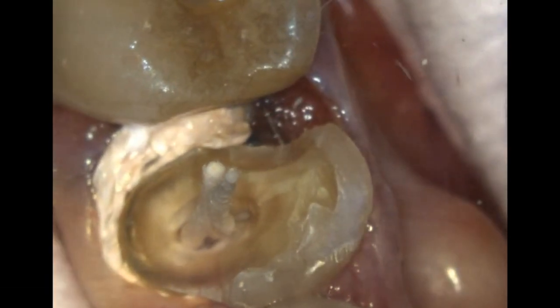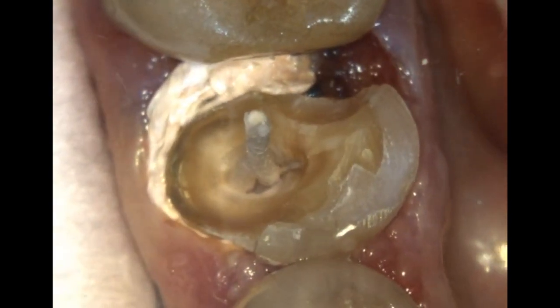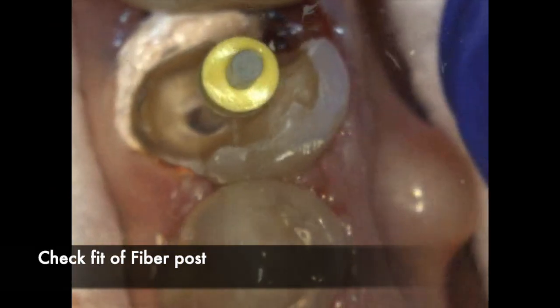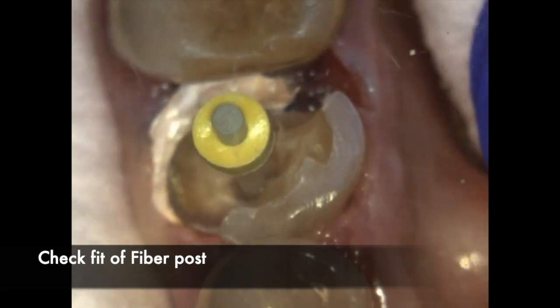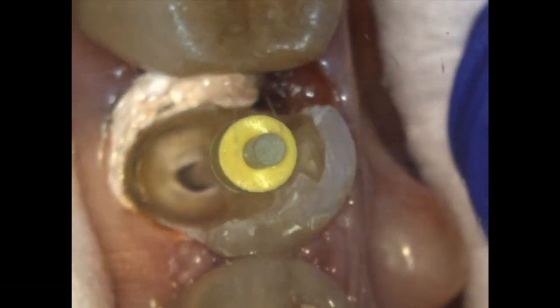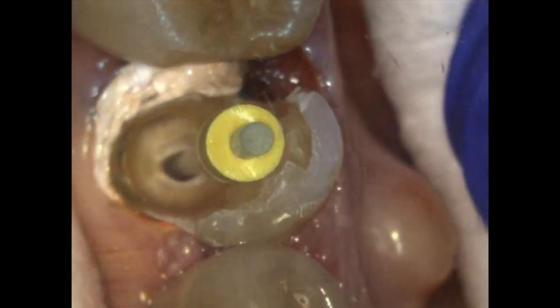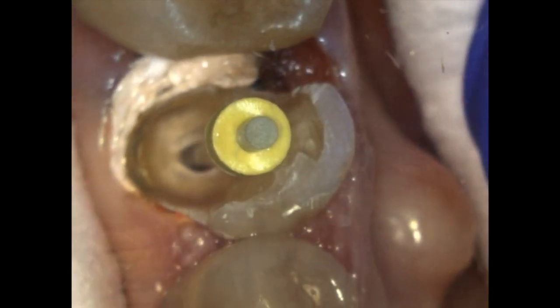In this case you can see I'm using paper points — you may need to do this a couple of times just to ensure the canal is completely moisture free. Before I start the bonding process, I'm doing one final check for the fit of the fiber post. I'm ensuring it is going to be tall enough, has a nice passive fit, and goes deep enough into the post space I have created.